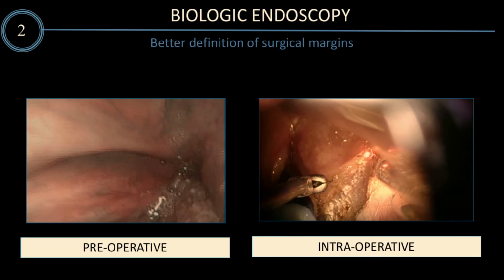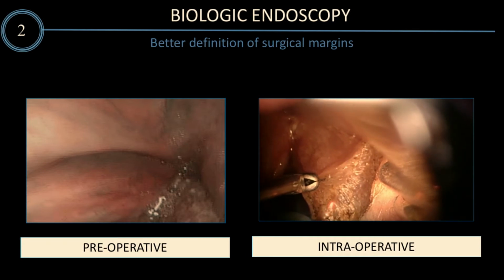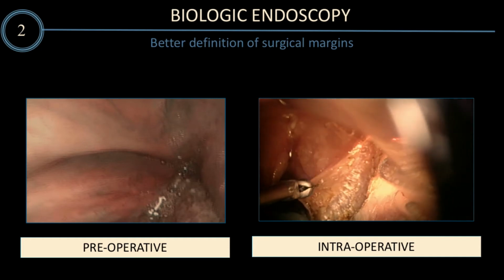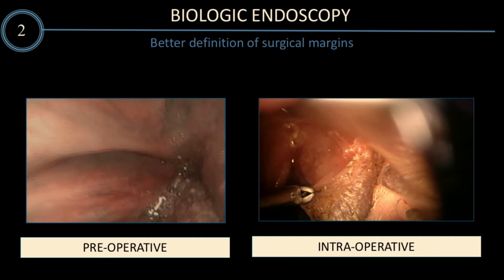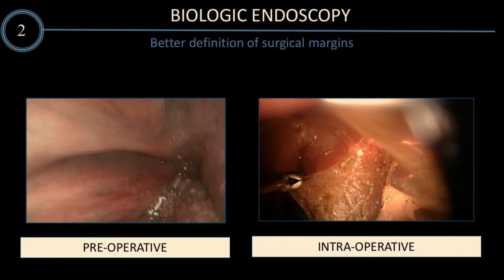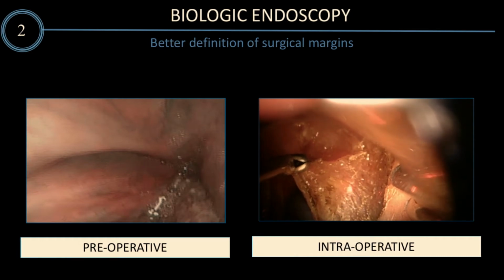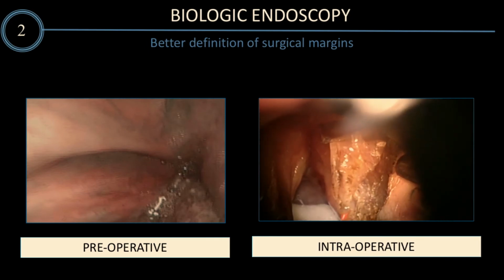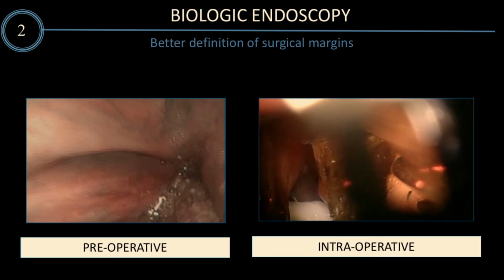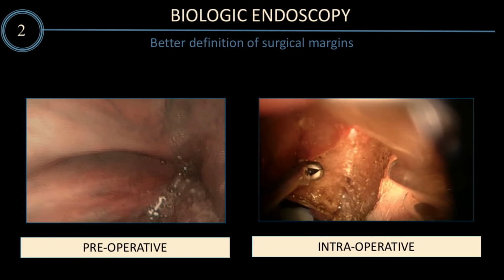So this is very important to have a complete resection of the lesion with free margins, and you can unify in the same procedure the diagnosis of the entire lesion and the final treatment if the histology confirms the clear margin of the resection. So this is the goal of TLM: to simplify the treatment in order to have a unique procedure for diagnosis and treatment, and of course to spare as much as possible the multilayer structure of the vocal cord, to reach a compromise between the oncological radicality and the functional outcome.